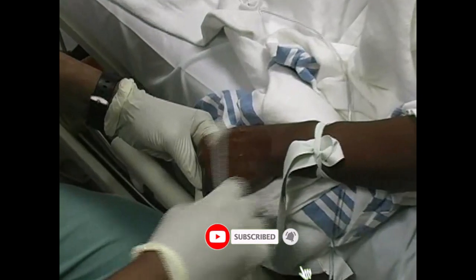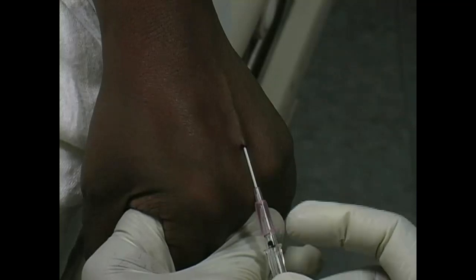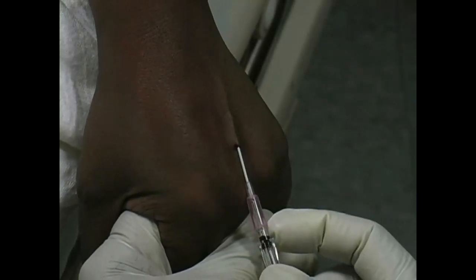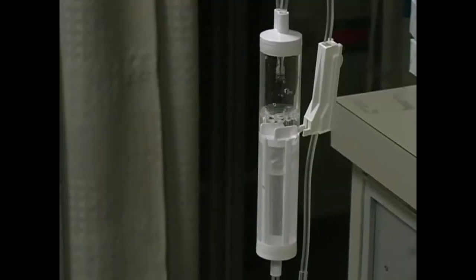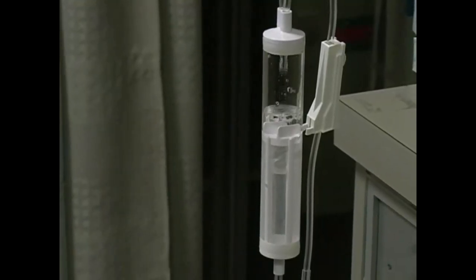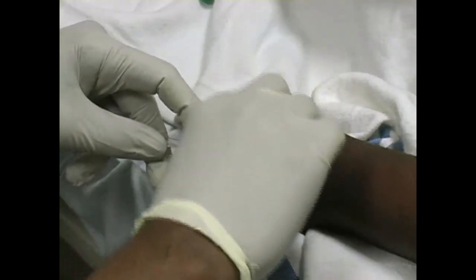Select a distal vein in the affected limb, in this case the hand. Cleanse the site with alcohol. Proceed to insert a 20 or 22 gauge catheter into the vein. Ensure that the catheter flows easily. Secure the catheter to the skin with tape.